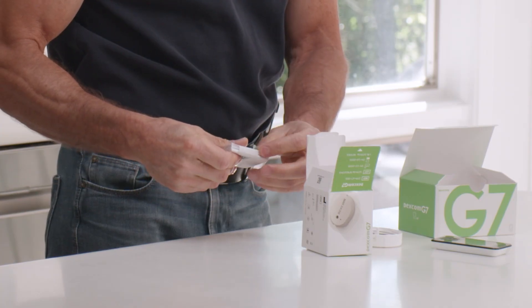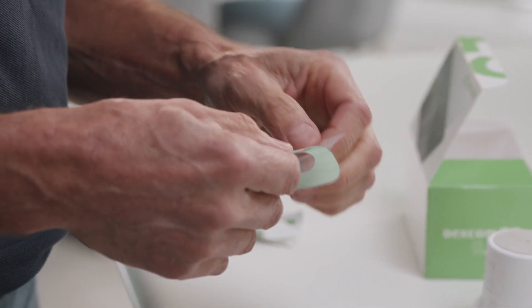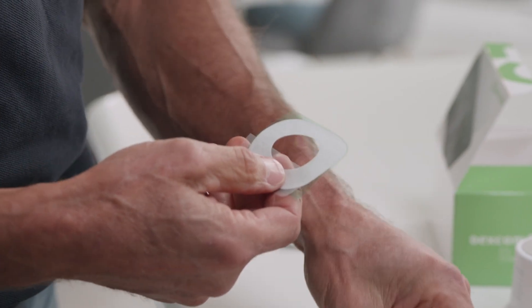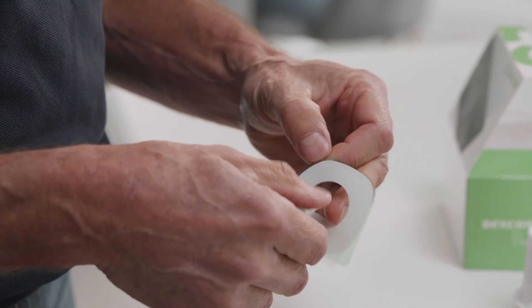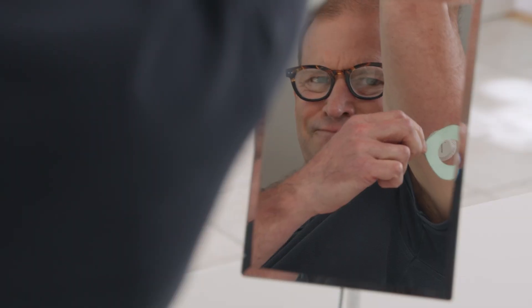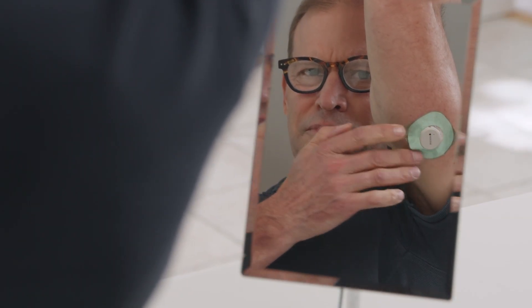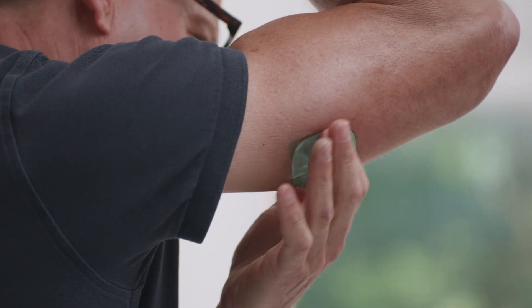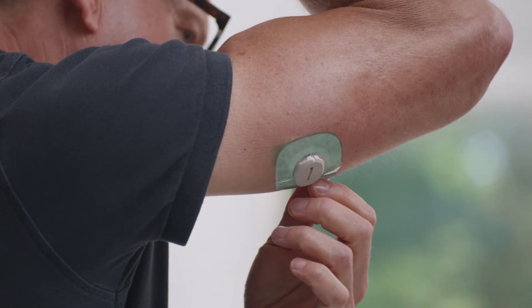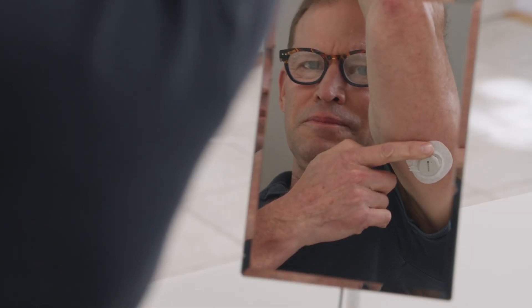Your overpatch will help you keep the sensor on and is bundled with your instructions in the box. Carefully pull off the clear liners one at a time. Don't touch the adhesive area. Use the tab to place the overpatch around the sensor. Rub around the overpatch. Use the tab to peel off the liner, then rub around the overpatch.